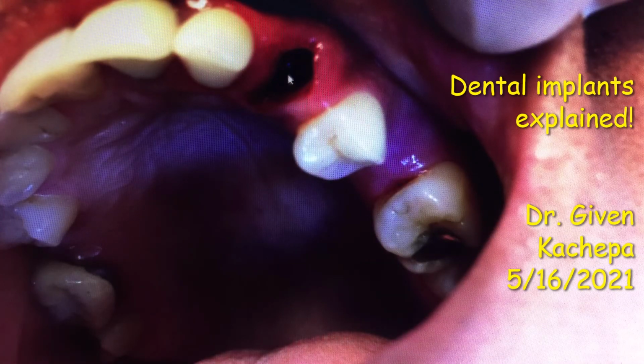Here was a case that we ended up doing an immediate implant. An immediate implant is basically where you take out the tooth in one appointment and then you place the implant that same appointment, if you can justify that there's enough bone on the buccal here and on the lingual here. What I ended up doing in this particular case was I make a flap. I make an incision here and an incision here and I flap this out so I can see the bone really well on the buccal here and on the lingual here, and that tells me also what size of implant I need to place in there.